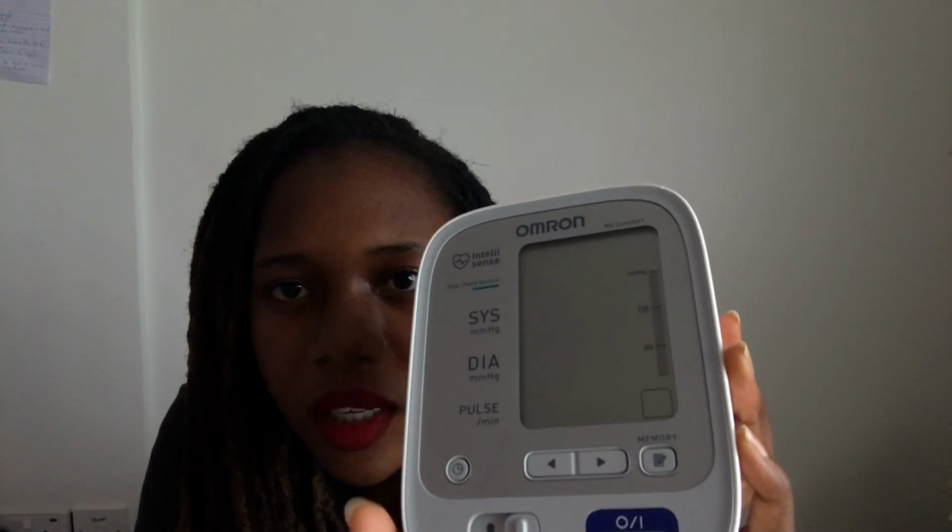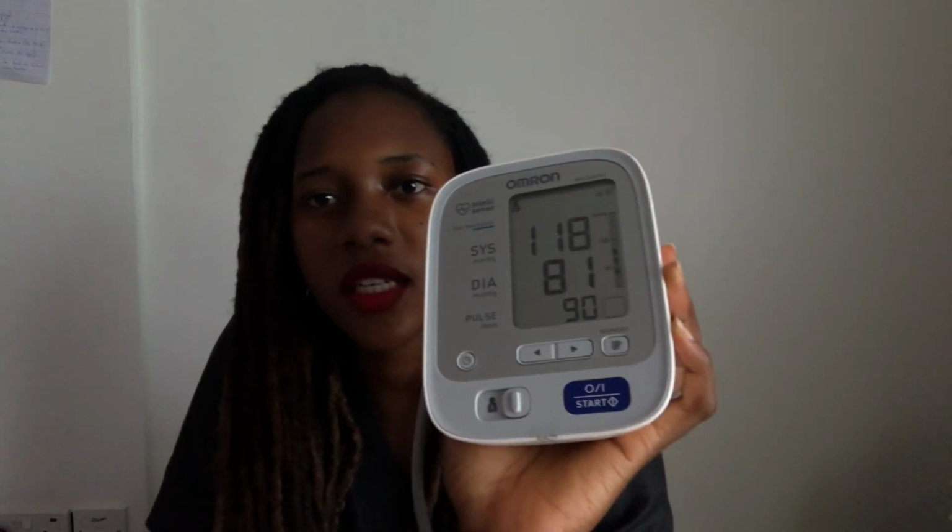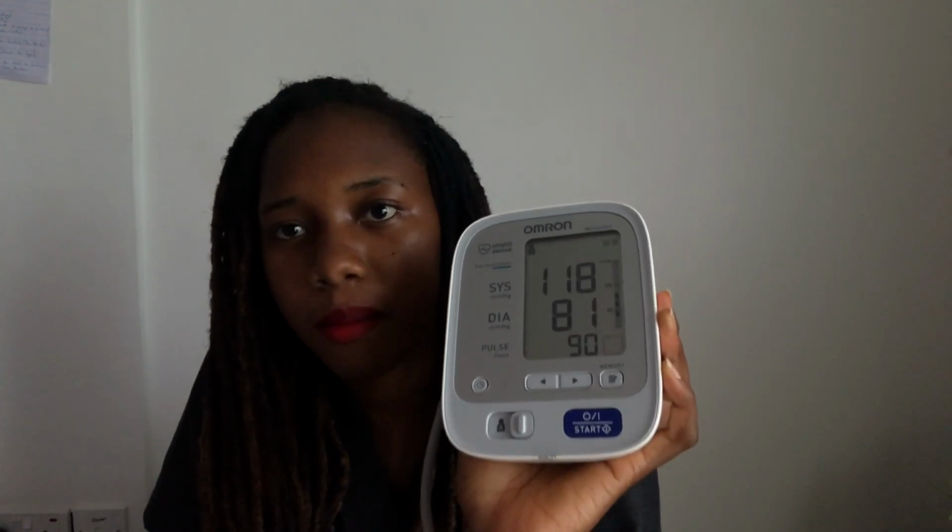But just in case you forgot your last blood pressure readings, you have this for memory. It has a word memory. Hope you can see it. When you press it, it brings the very last blood pressure reading that was taken on that machine. So you can go backwards so that it can show you different ones. You see, so different readings are on this machine.